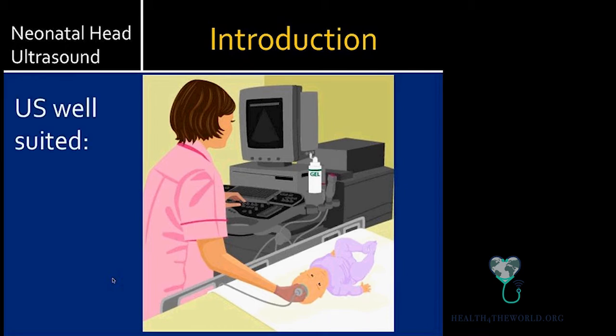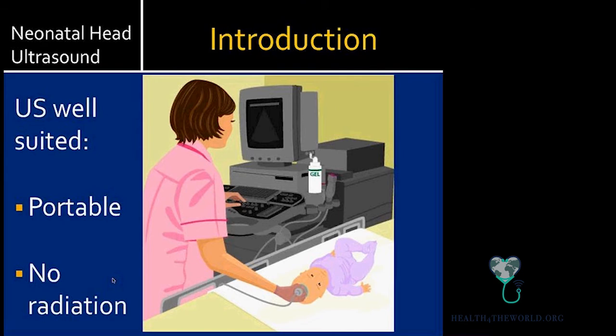And ultrasound comes into play. It's very well suited for answering many of these questions because of its portability and because there is no ionizing radiation. In fact, you can accommodate for a lot of the motion with this real-time examination.